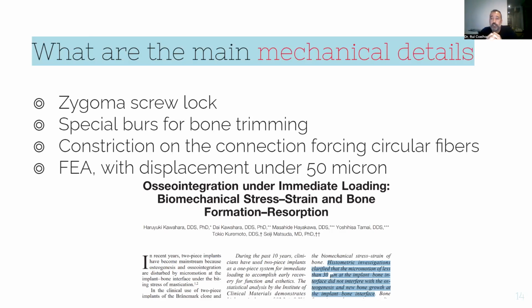But anyhow, it's not a success. You cannot compare this type of success, only because you cannot take it out. You don't have to take it out, sorry. But it is not the same success as dental implants, okay? For a dental implant, if it has movement, it has to be removed, okay? And the same for us. For us, every implant that moves is a problem, and we have to remove it, okay?